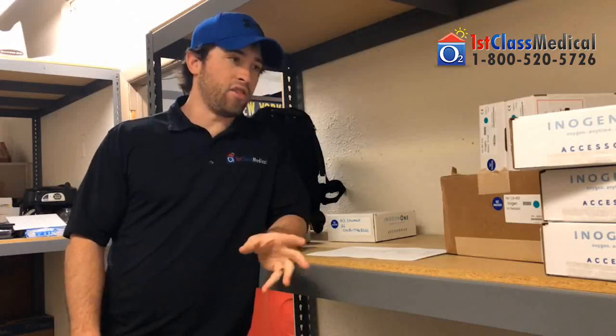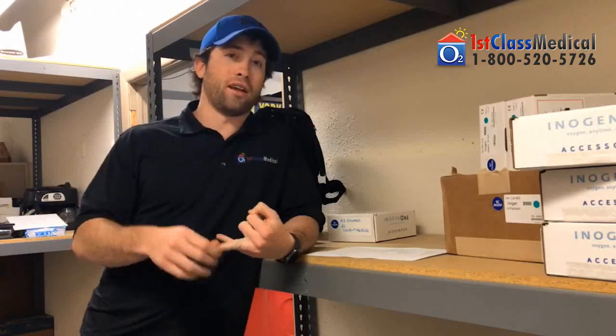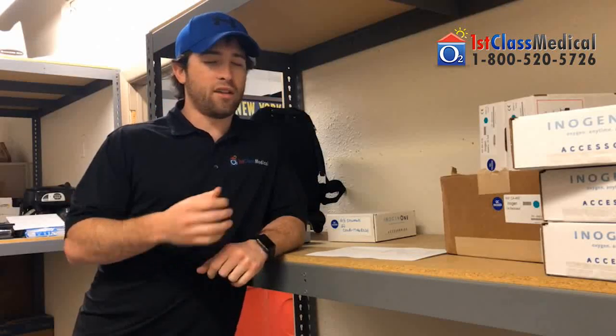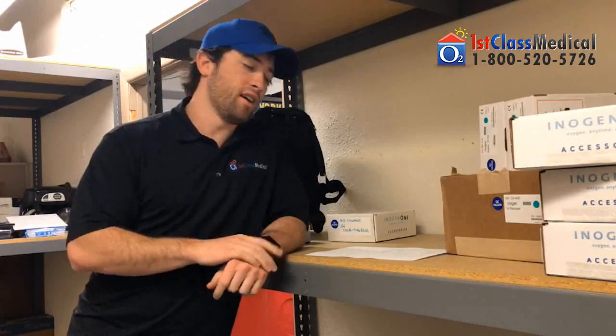That being said, the difference between a continuous and pulse flow, sorry, I probably should have started out with this. Continuous flow is a steady flow of oxygen. It's like your stationary oxygen concentrator, that's steady, that's the continuous flow. Pulse flow is also known as on demand. You hear a lot of tanks or conserving devices do this, where when you breathe in through your nose, you get that psh, psh noise. That's the on demand. It's detecting that breath and giving you the oxygen when you demand it.